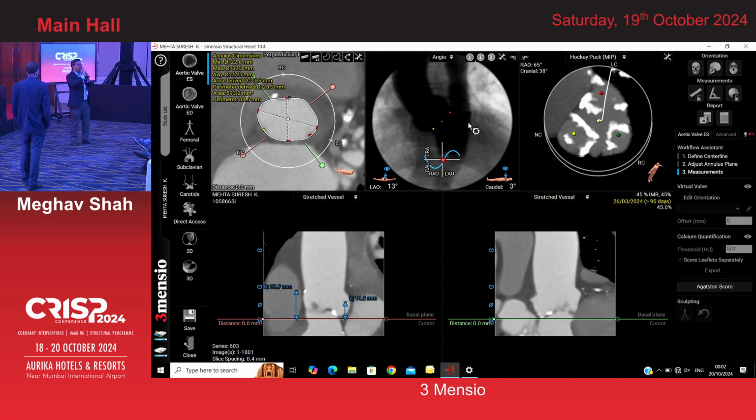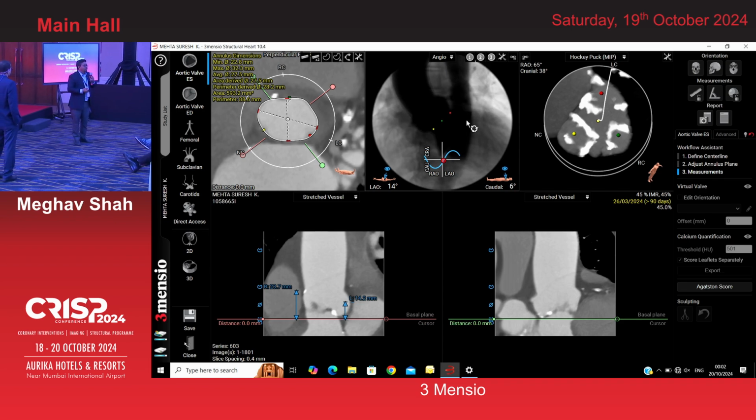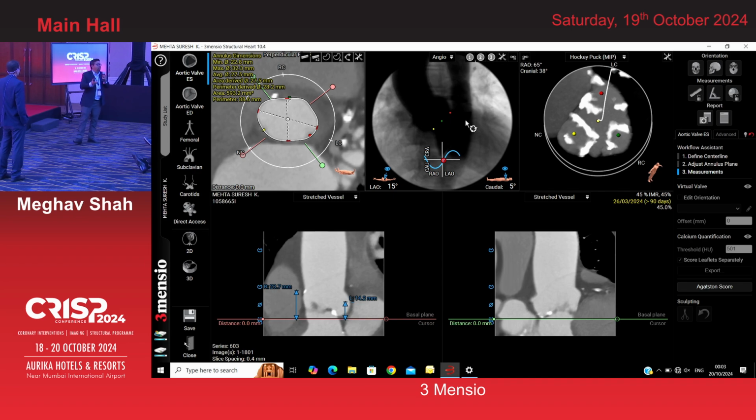People are looking at it in certain ways. If you do any intervention, everybody has their own way of looking at it. You develop that because you are continuously doing it. We are being deprived of this opportunity to learn through looking at the images again and again.